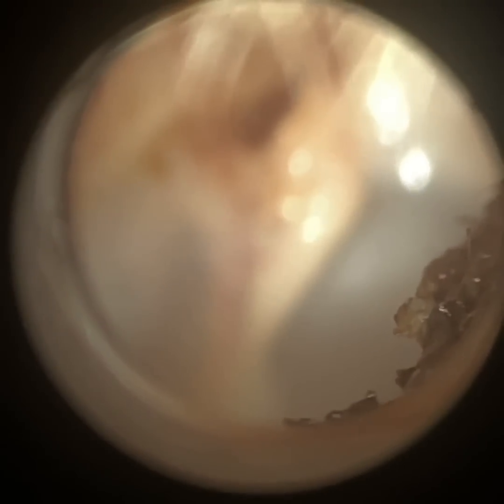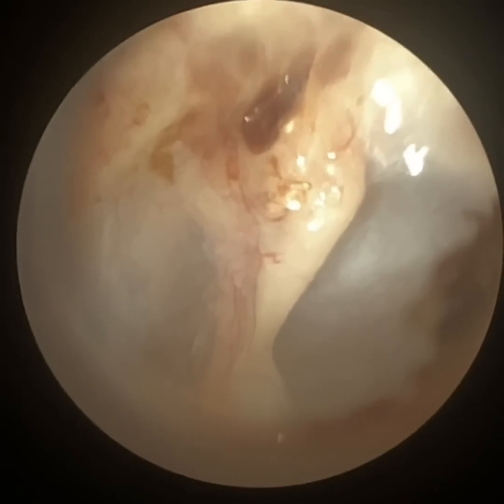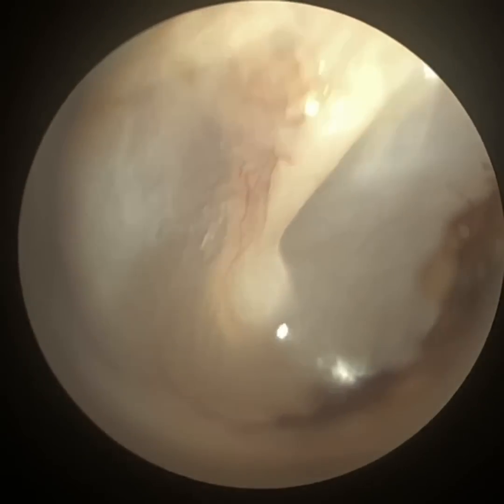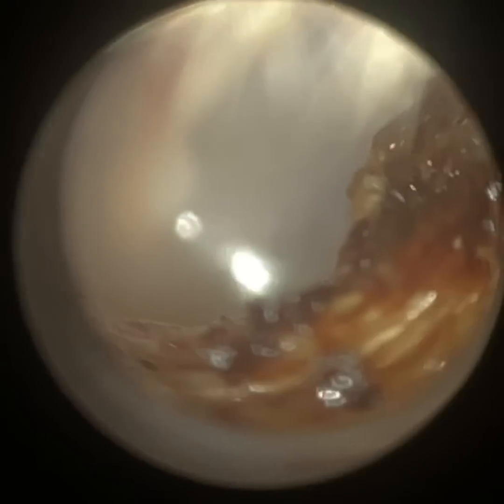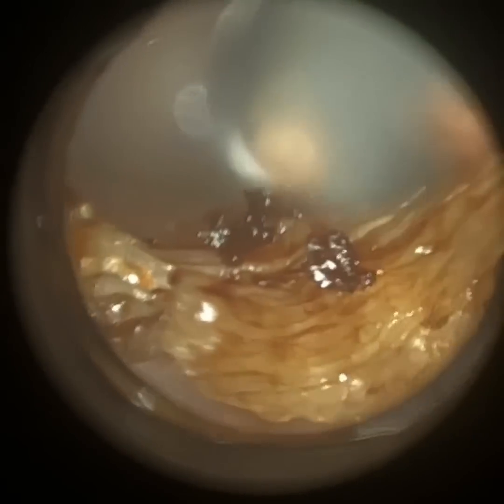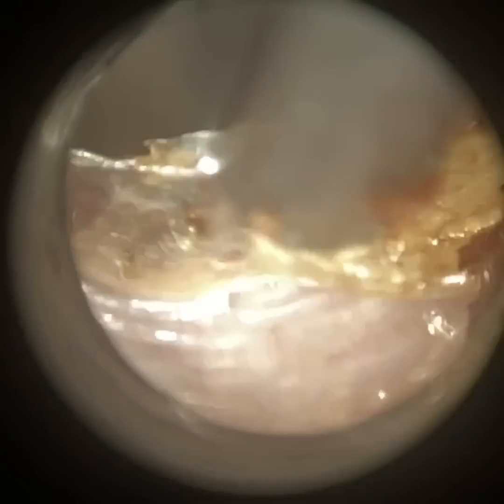So, managed to remove that last plug, and that was trapped up against the eardrum. I'm just going to get the eardrum in focus. There's a bit there just on top of the hammer bone. Not really concerned by that. And so as we approach the eardrum, we've got this sheet of dead skin that's still on the canal wall. I'm going to peel this away, and then the eardrum dips as we approach the end of the ear canal.